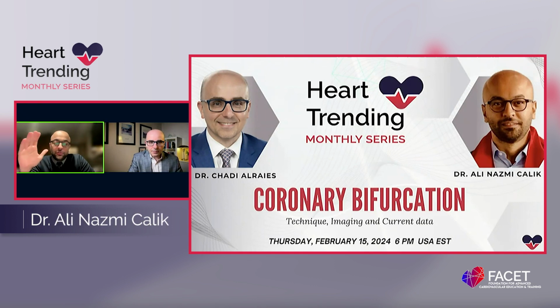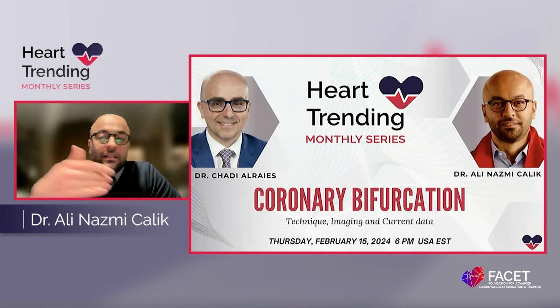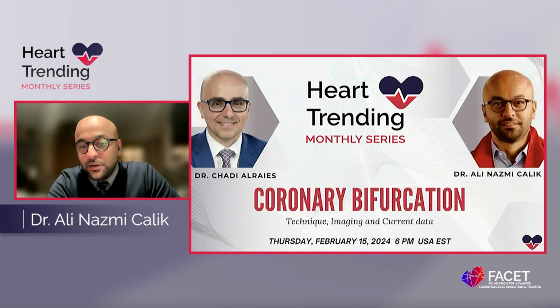Of course, I do around 80% of my cases with my workhorse guide wire, which is a choice floppy. But when it comes to challenges in crossing the side branch ostium, which is really calcified, of course, I choose hydrophilic wires. But we need to always be really, really careful with the hydrophilic wires because they can easily go through the dissected planes, particularly. So yes, my first choice is my workhorse. My second choice in challenging, calcified anatomies is the hydrophilic guide wires.